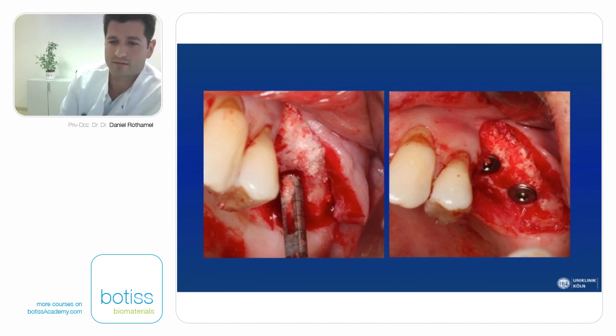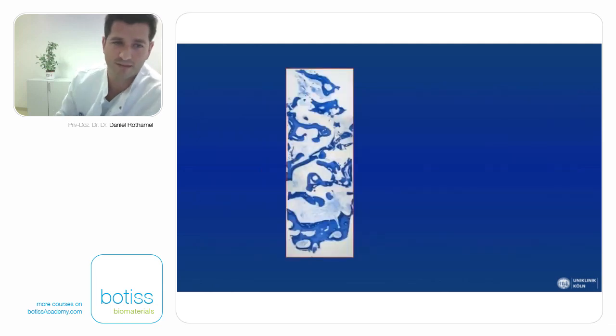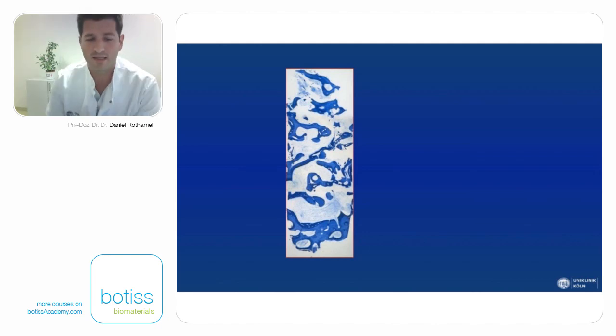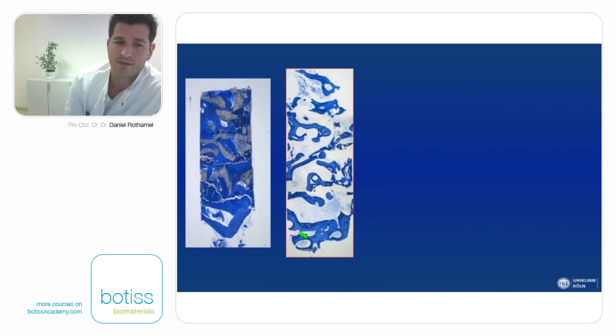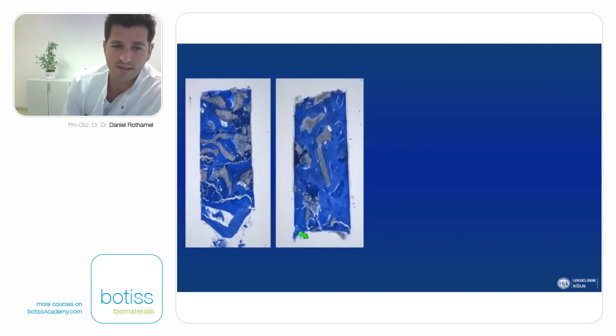And when we compare these trephines with a trephine, for example, that was harvested after sinus floor elevation using a hip graft, we can easily see that there's a big difference in bone quality. This is after a hip graft sinus grafting procedure. We can see the remaining bone height of about 1 millimeter, and there's a vital bone matrix inside the sinus cavity, but the quality of the bone is more D3 or D4 bone. So it will improve after placing the implant and performing functional loading. But when you compare it with the trephines we took from this patient, we can easily see that the bone quality is much better when placing some bone substitute material into the sinus cavity.